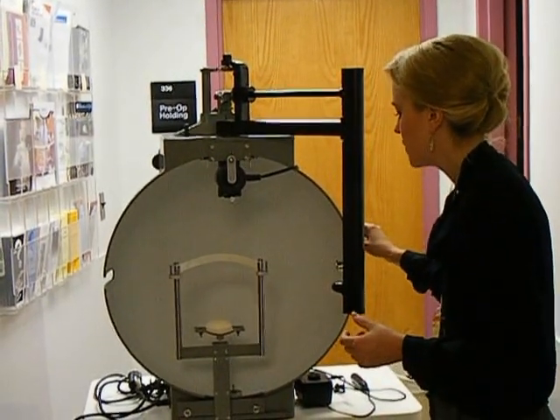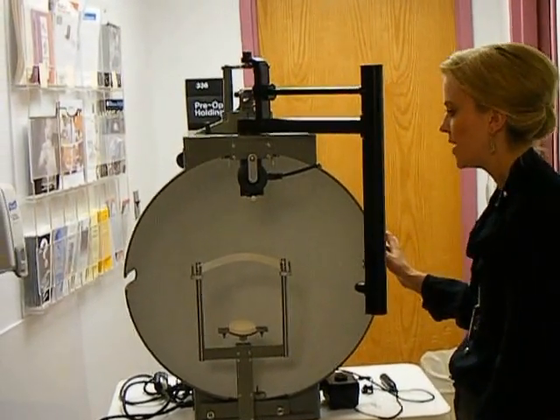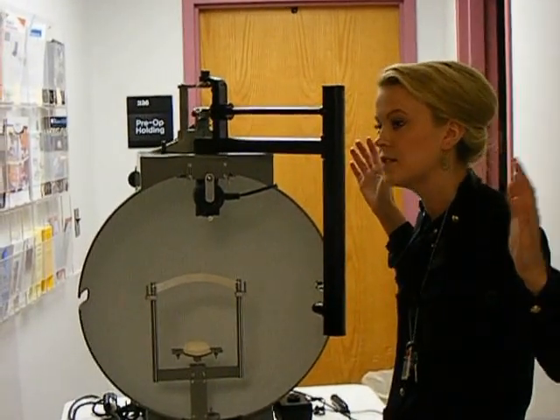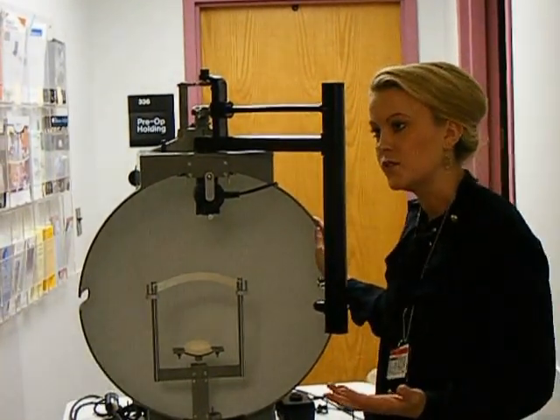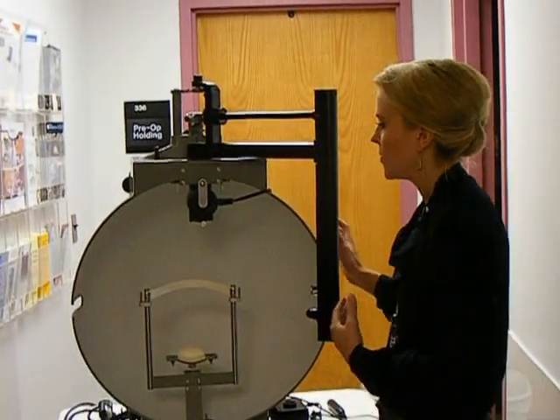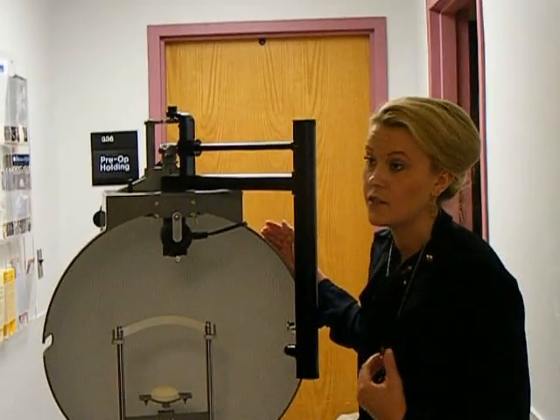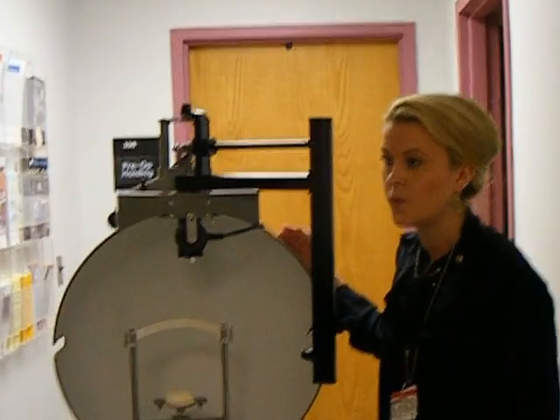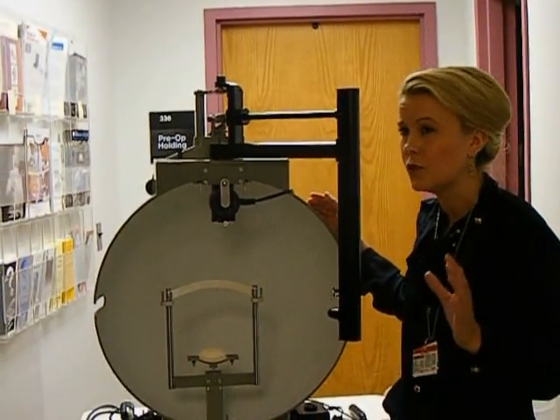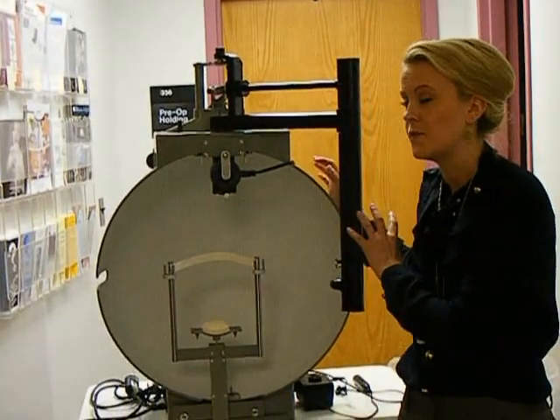This is a Goldmann peripheral visual field. One of its unique features is that it actually measures right out to the very limit of the visual field — out to 90 degrees. Most visual field machines in practices have a bowl that's about two-thirds the size, so they only measure out to 60, and often only to 30 degrees. So when we're talking about walking, driving, and the absolute limits of a person's capabilities, we really need this measurement.